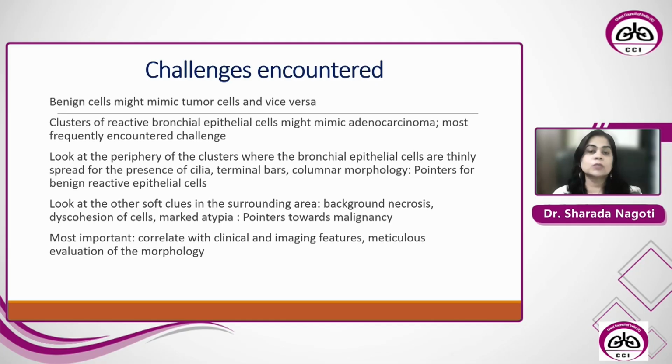The most important thing which we have to keep in our mind is always correlate the features with clinical imaging features, and meticulous evaluation of the morphology is very much essential.